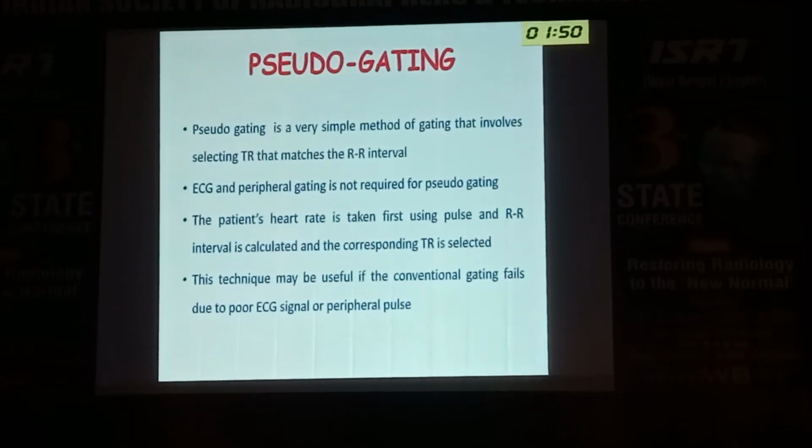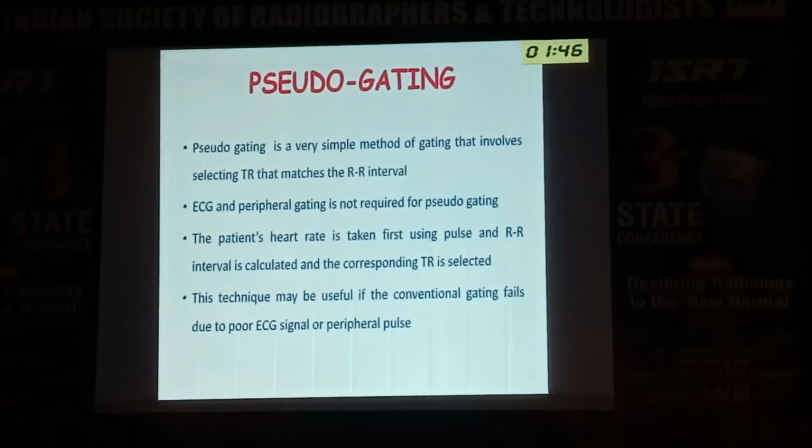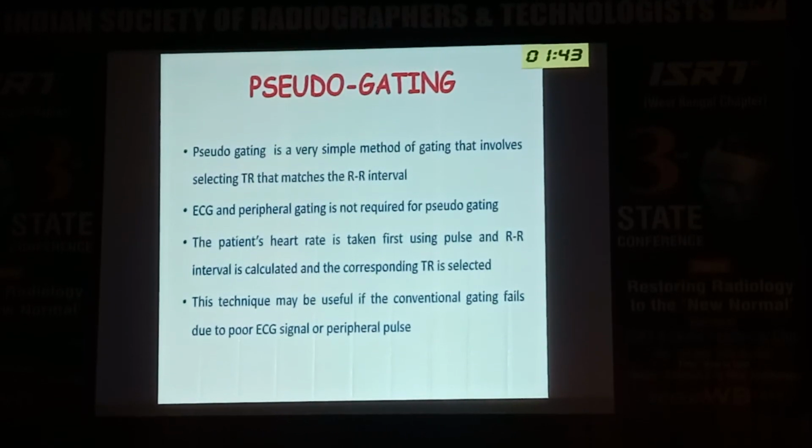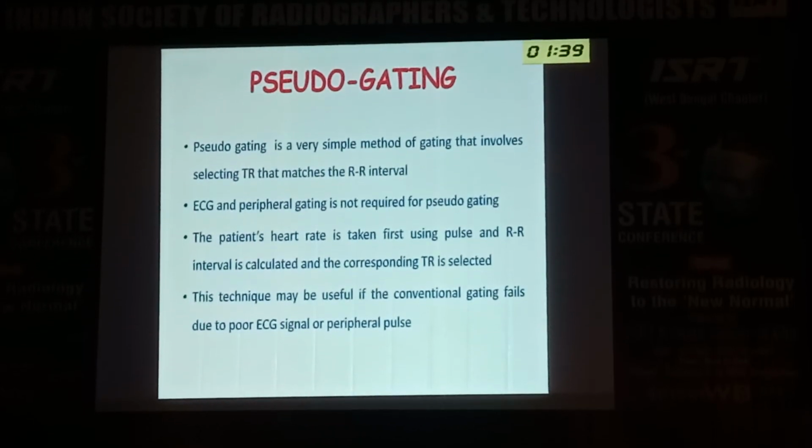Last one is the pseudo gating. Pseudo gating means I'm not going to use any device. I simply connect the ECG leads. What is going to be displayed on the monitor? ECG pattern. I know this is R wave, another R wave. What is the R wave distance?